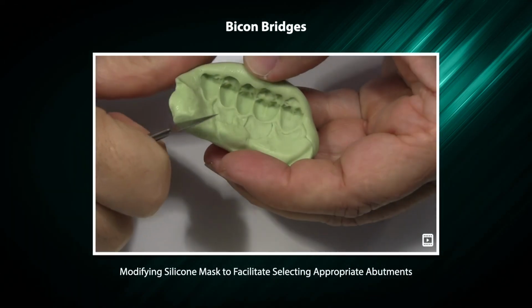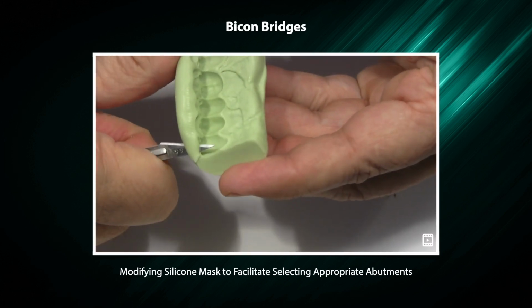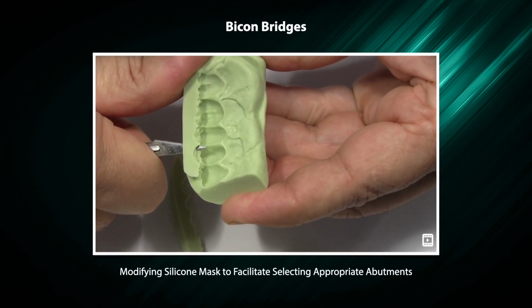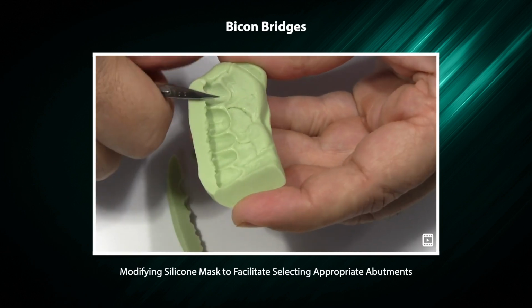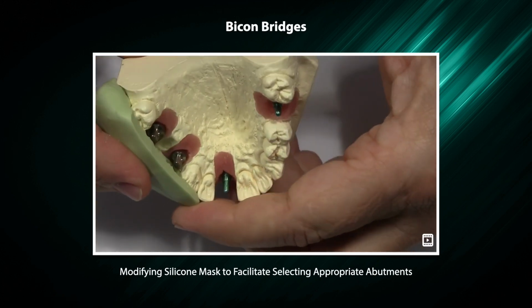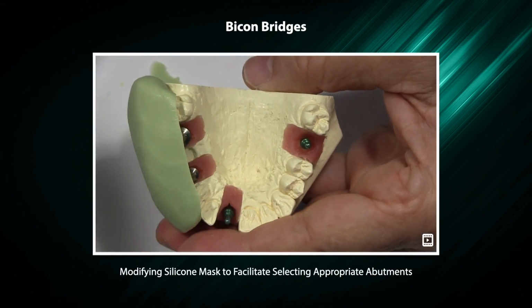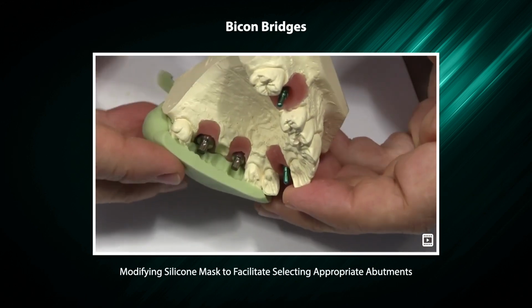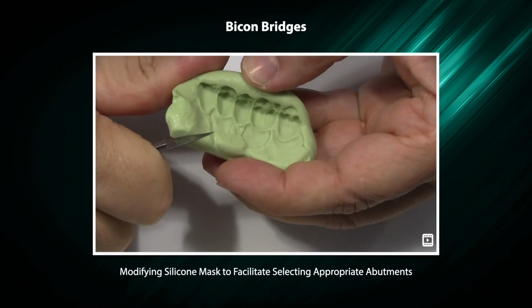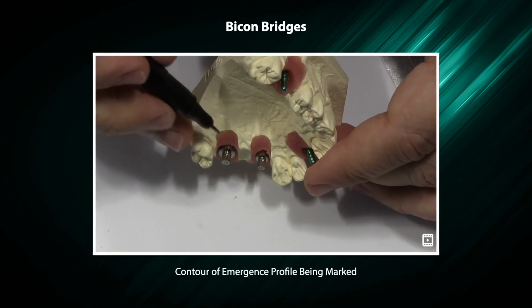Modifying silicone mask to facilitate selecting appropriate abutments. Contour of emergence profile being marked.